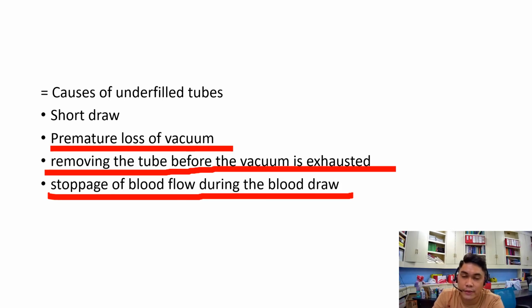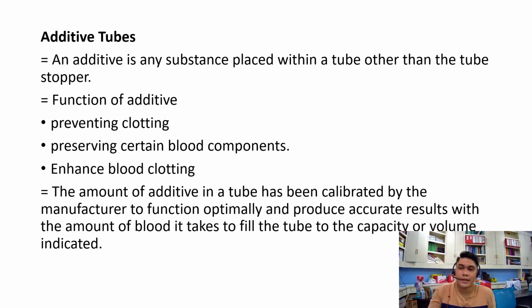For example, vein collapse. So there will be a stoppage in the blood flow, and that can cause underfilled tubes.